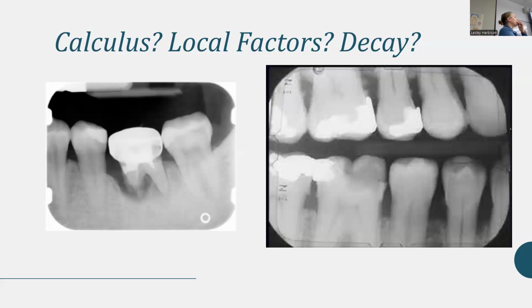You? I would probably say a 2. Yeah, we're probably getting up to maybe a 3 up here, but we lose a little bit of visibility. Now, one thing you guys can make note of, but really this application won't be until you get into clinic, but we stage in the area of the most severe disease.